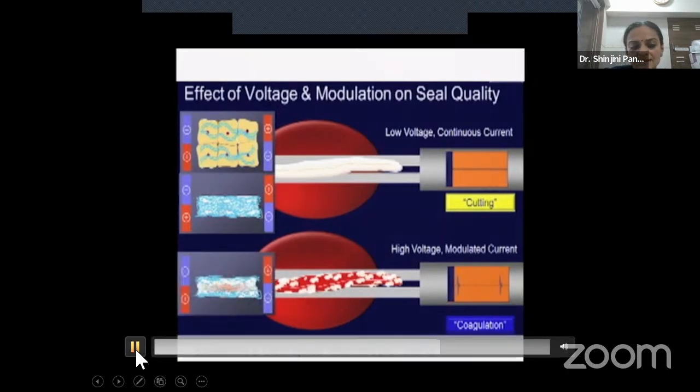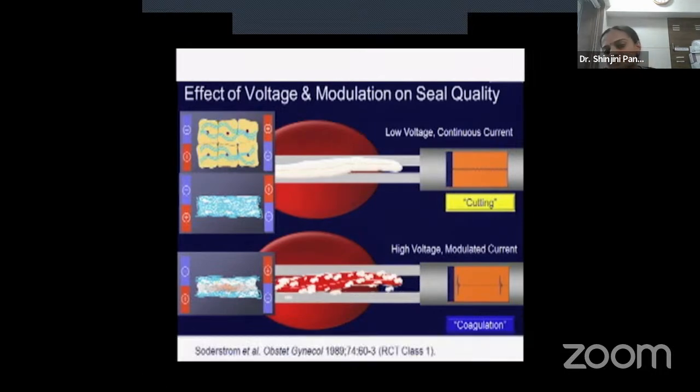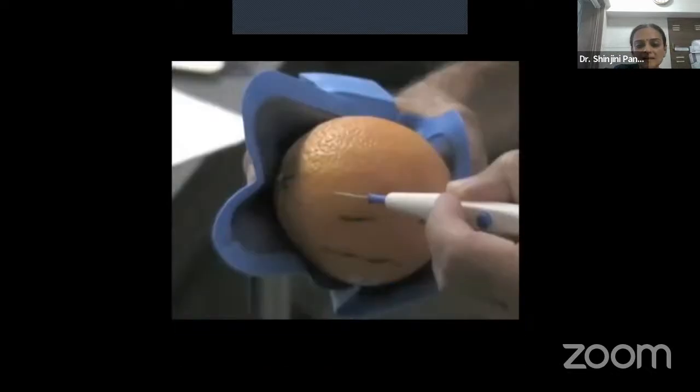Now, you will say that we have all our life used the blue pedal to buzz the surgeon's artery forceps. But see, all these vessels are basically quite small, the ones that bleed on the rectus and all. Many times when you leave, it bleeds again and again, you have to touch. Try using the yellow, but be patient. Use it for a longer time. It's a perfect seal.